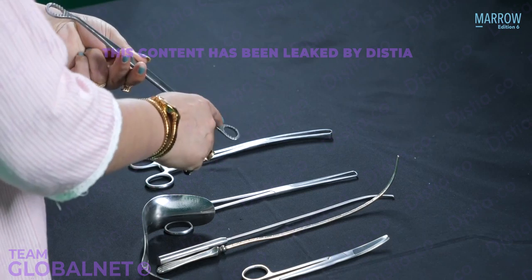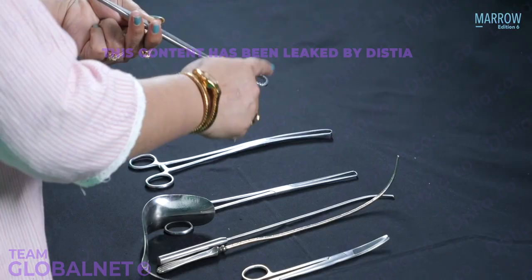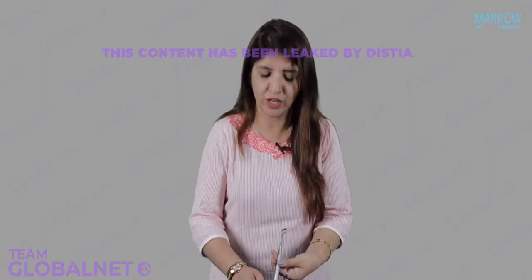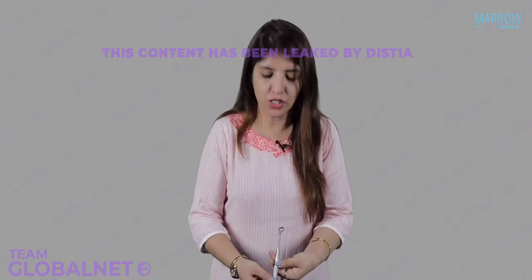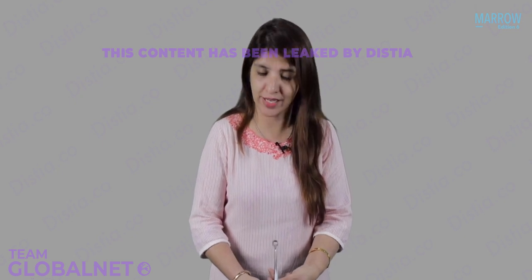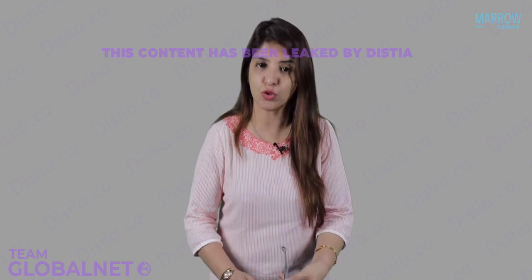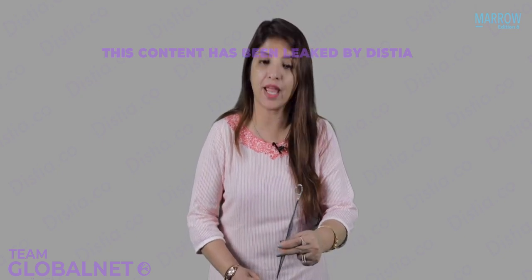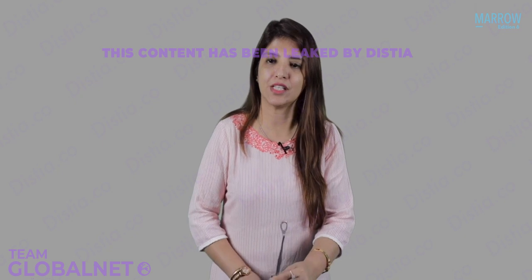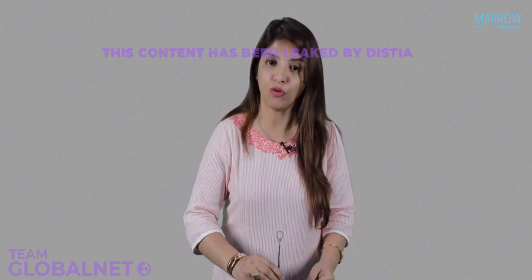And these loops have got serrations or fenestrations ahead, right? So both the ends, there are loops with fenestrations present. So this over here is an anterior vaginal wall retractor. So with the help of Sims speculum, I'm going to retract the posterior wall of vagina, and with the help of this anterior vaginal wall retractor, I'm going to retract the anterior wall of vagina.